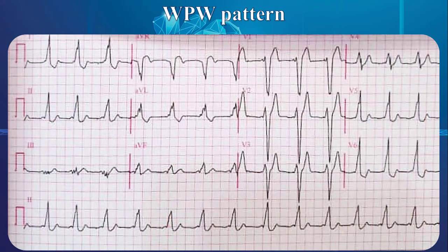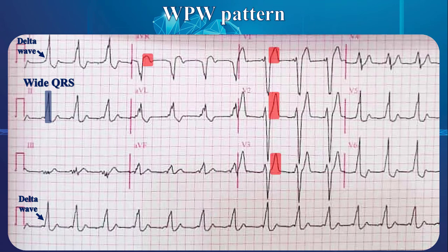The next EKG demonstrates WPW pattern. Thanks to delta wave, the complexes are wide. There are discordant ST elevations in V1 to V3 and AVR; discordant ST depressions are discernible in V4 to V6 and inferior leads as well. Like the previous strip, STT changes in this strip are because of wide complexes.